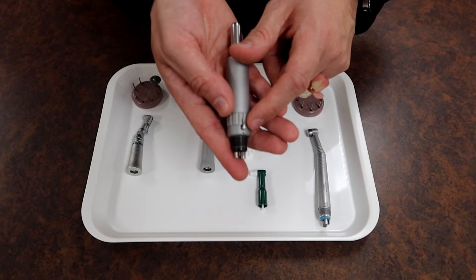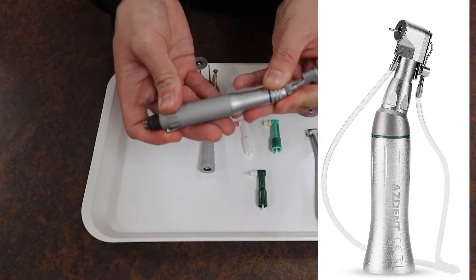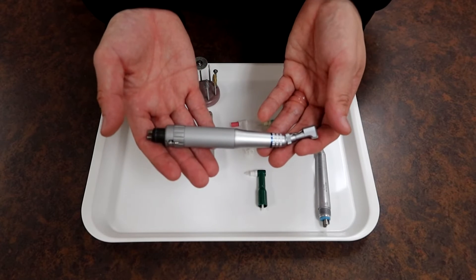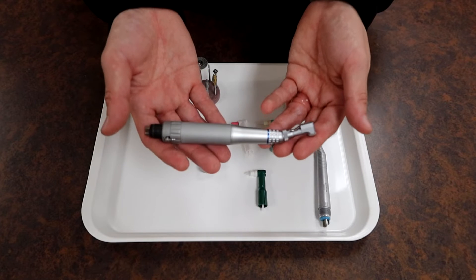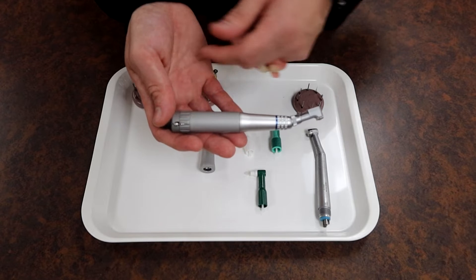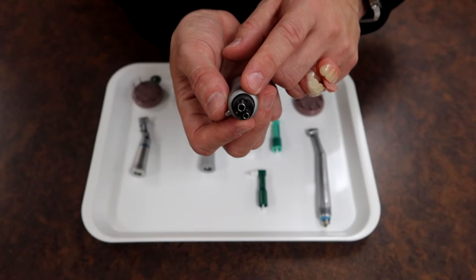That waterline port is nice because it accommodates a little hose to shoot water, for attachments that go off the top that may require water. Generally, slow speed handpieces do not come with the ability to spray water for cooling the tooth, but for certain things you might have this port available.